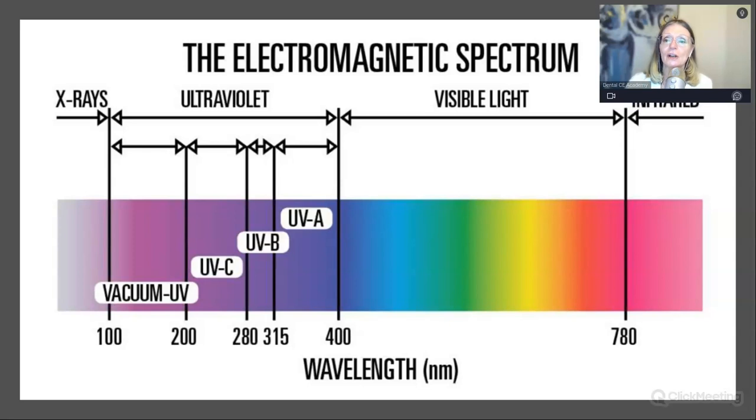When you get up to IR, you're not going to necessarily see that, right? It goes past the 780. And in tomorrow's presentation, a developer of one of these photobiomodulation devices will demonstrate that. You'll see it light up at about the 606 nanometers, I think, or 660. But when you get up to the 930 range and higher, you don't see the wavelength anymore because it's not visible to your eye.